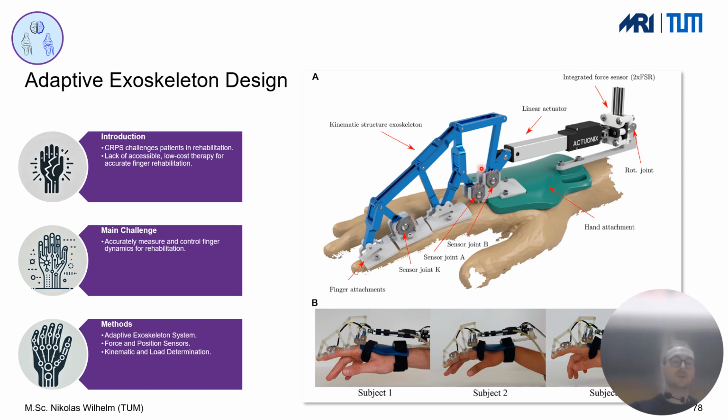And then how do we measure all the forces in the respective system? There was something special for the CAD design. But what we figured out was that this whole system is a linkage structure. So by knowing the external forces applied here, so if we measure here, we can then solve for the whole system and solve for all the respective linkage forces within each of those rods. So that was the basic idea. And then we know not only the position of the exoskeleton via the position sensors, but also the forces in these rods as well.